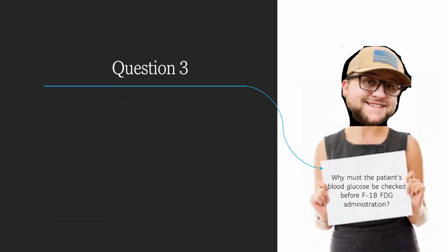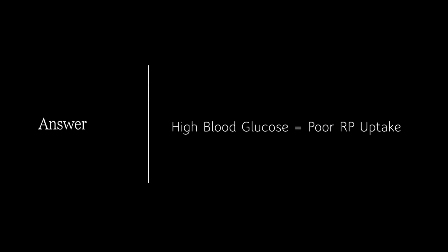Question 3. Why must the patient's blood glucose be checked before an F18 FDG administration? High blood glucose equals poor radiopharmaceutical uptake.